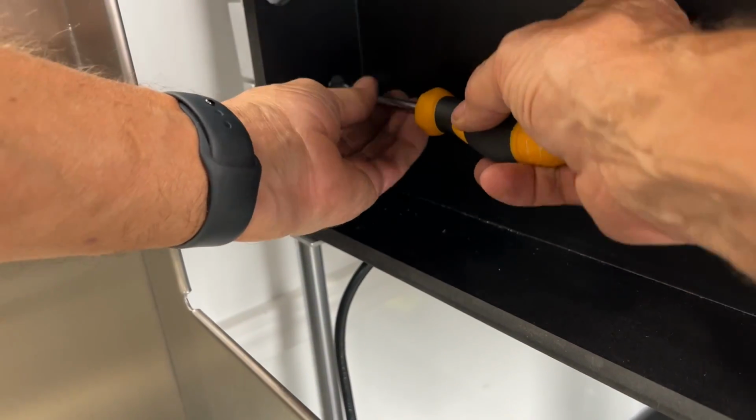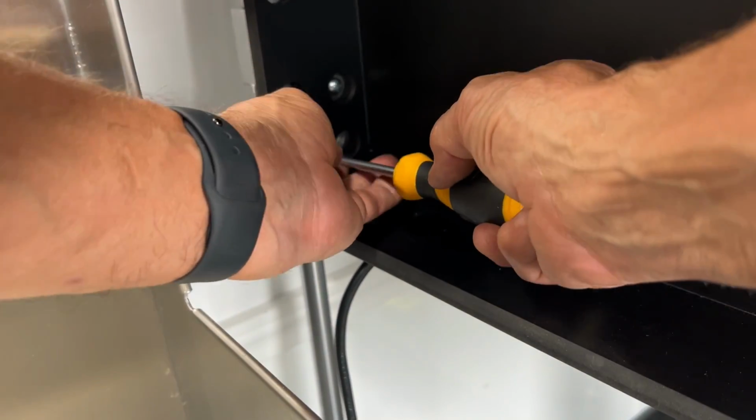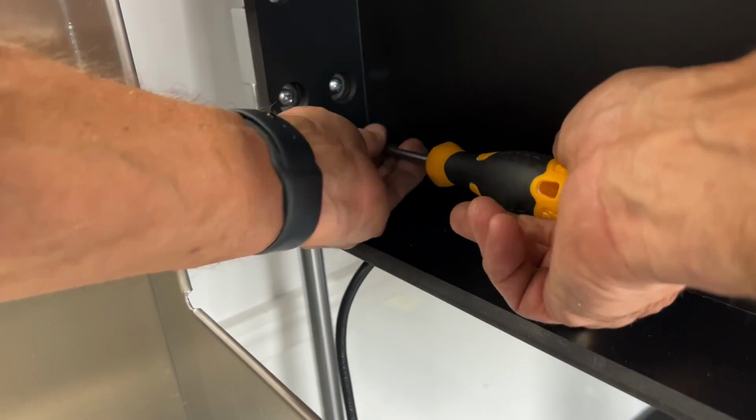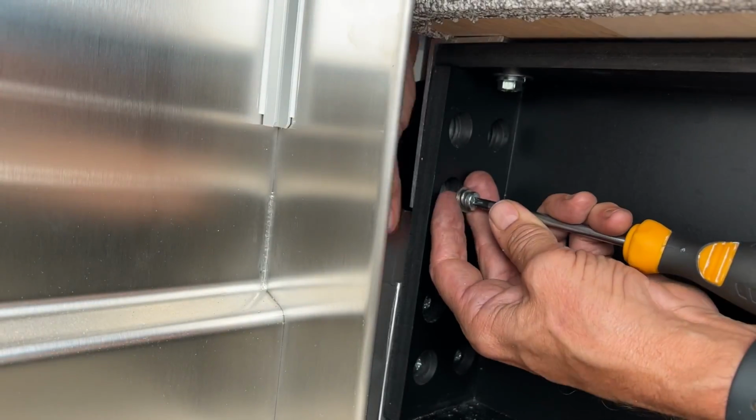Now all you have to do is just repeat this on the rest of the bearing screw holes, and do not tighten them all the way. We only want to put these on loose, so that way we do not get forced into having an alignment issue with any of the other screws.